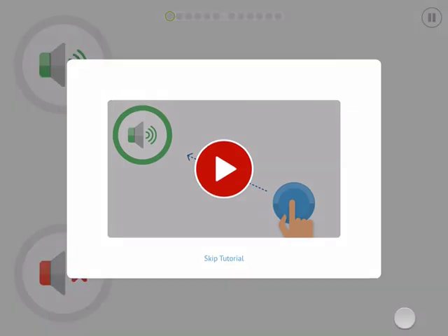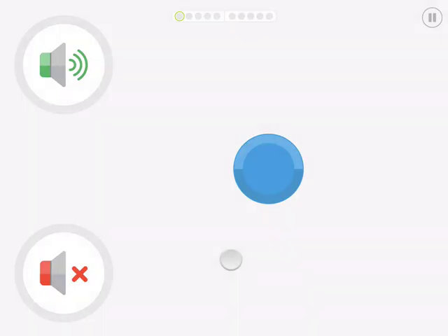The test will begin with an option to run through a tutorial for your test subject. This is designed to familiarize them with how the automated test works. You have the option to skip this step if it is not their first hearing test with Shoebox.